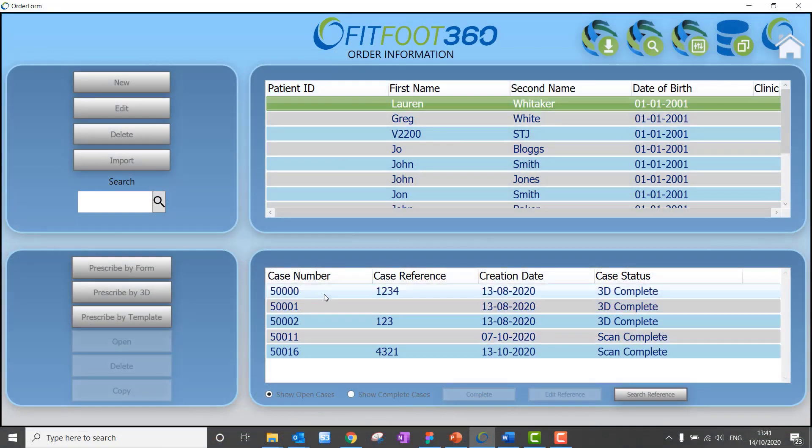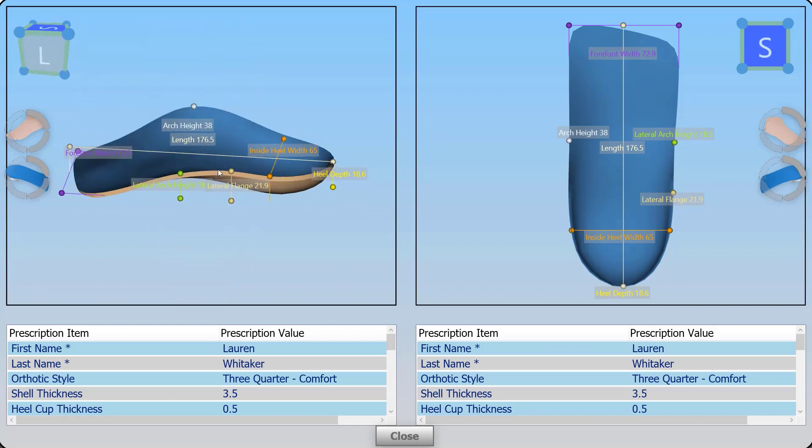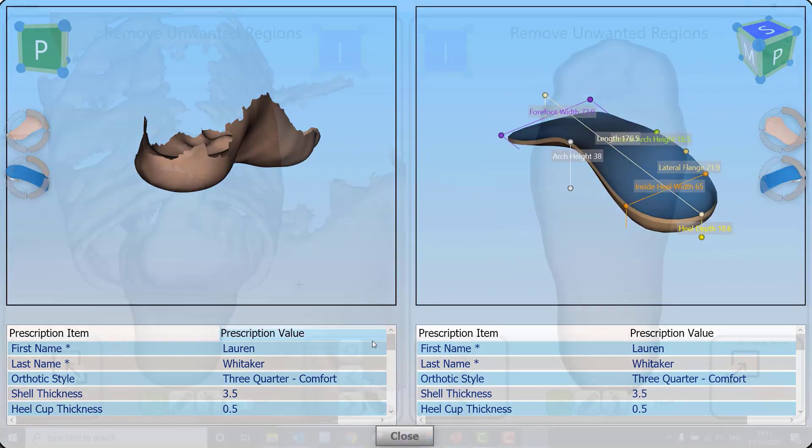So what have we added in version 3? Well, the first thing I'd like to show you is the ability to view a design without having to go inside. Straight from the patient area we can open and view the design and see what we've got.